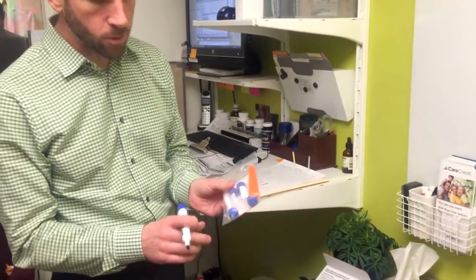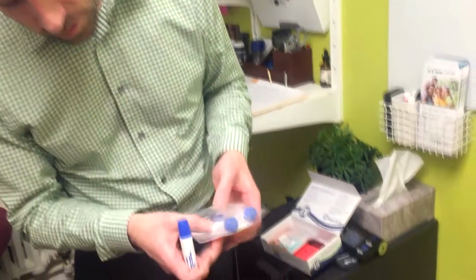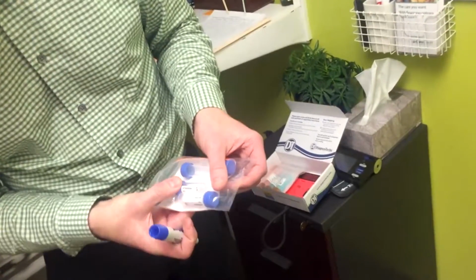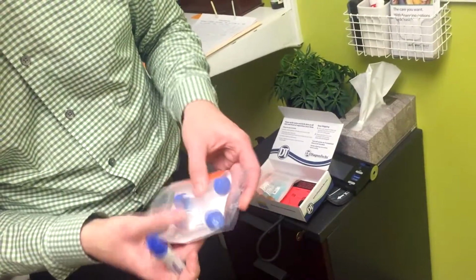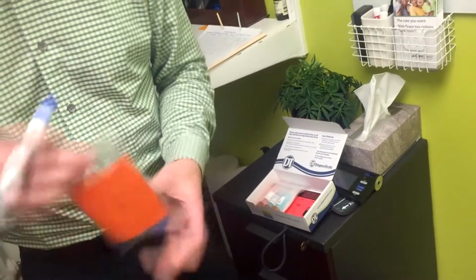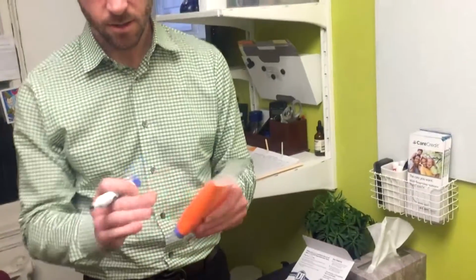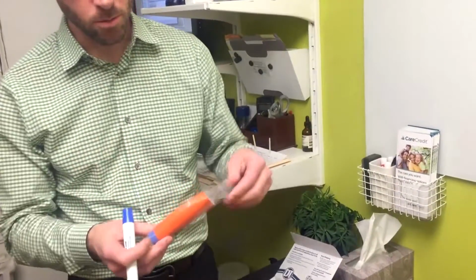So you've got 4 blue vials. Each is labeled with a different time of day. You've got afternoon, you've got midnight, you've got morning, and so each time of day is on there for when you're going to collect saliva into the tube.